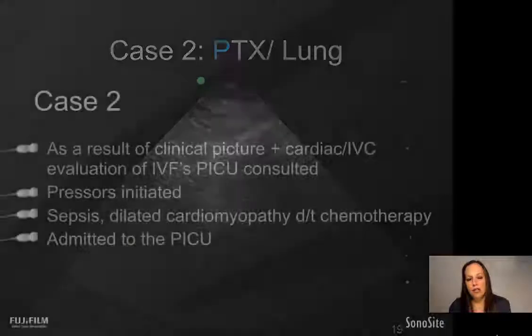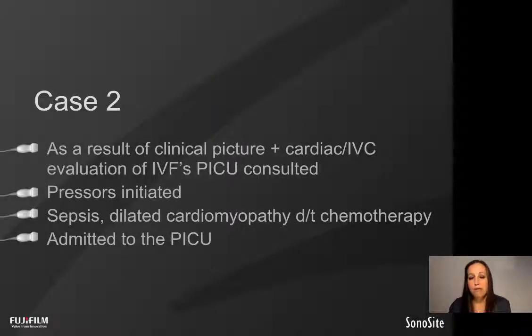So this is actually a really great example, especially in busy children's hospitals where it's often very difficult to admit a patient to the ICU. We can communicate with our intensivist colleagues very easily. We can show them the ultrasound images. Oftentimes, they may tell us when we call to try and admit to the intensive care unit that we should give more fluids to the patient. However, we can very easily see on this RUSH protocol that the heart needs inotropic support, that we shouldn't be giving additional fluids, especially since the inferior vena cava is plethoric. So we can communicate with each other and ease transition of care and admit the patient more readily.